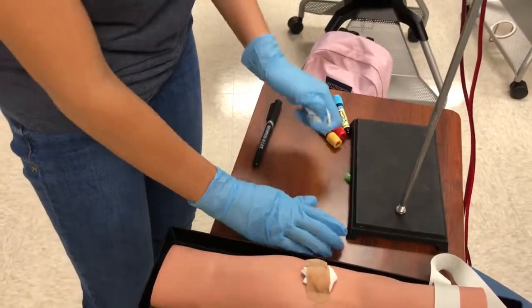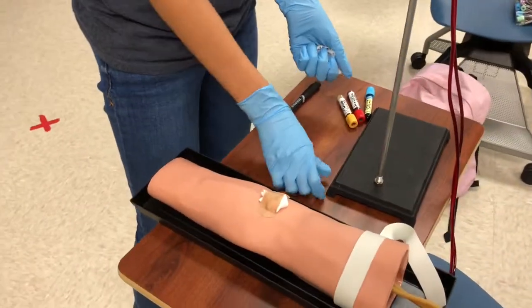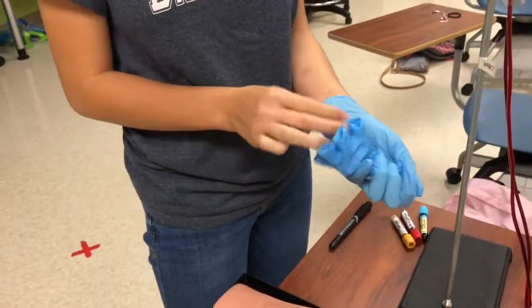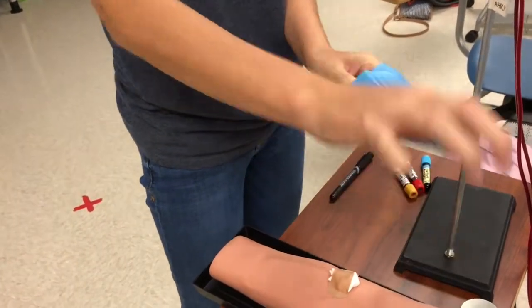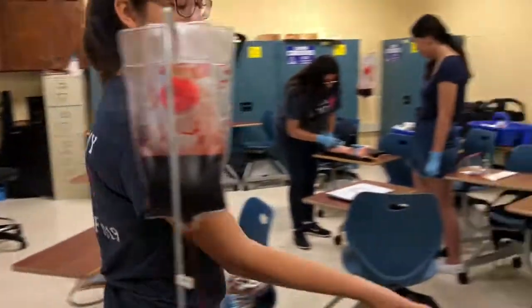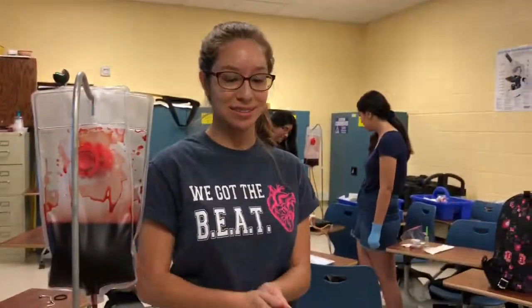Now I clean my supply area. Everything goes in a trash can or bag. I remove my gloves as well, using the correct technique. I throw my gloves in the trash and thank the patient. After the whole procedure, I wash my hands again with Germ-X in front of the patient so they can see.